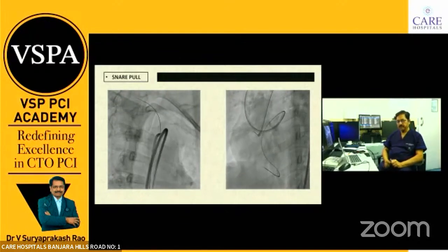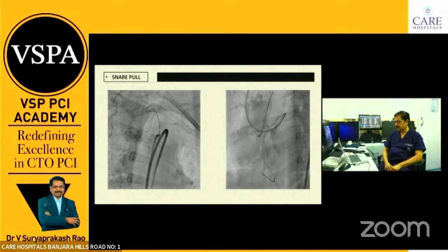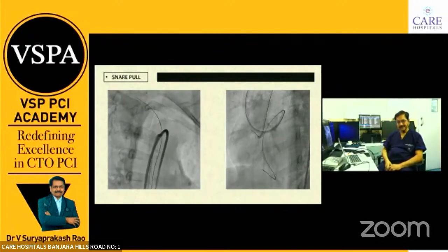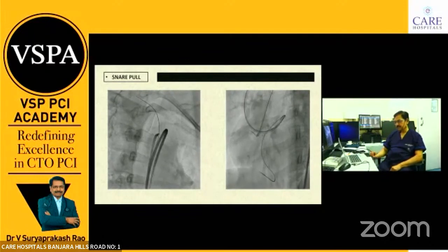When you pull out these wires, see that the guiding catheters are disengaged. This is important because the guiding catheters, either antegrade or retrograde, can suck in and produce dissections, which if you don't notice after shifting the patient, you can have problems.